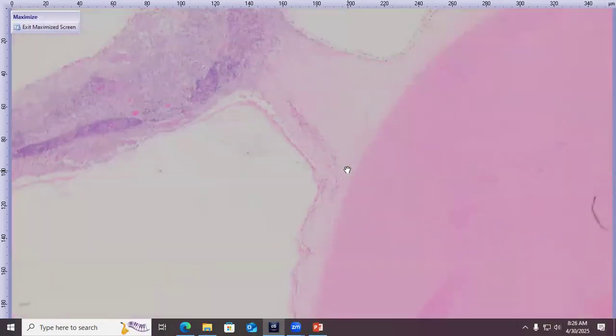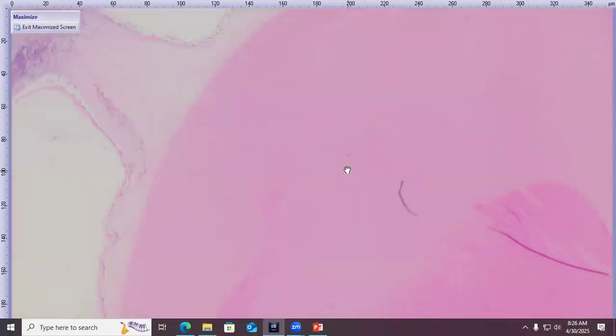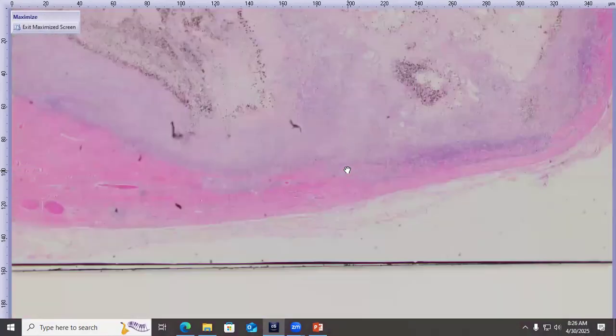And the other eye looks much the same. There's not much else to say about this case. Certainly there's a really severe cataract in both eyes as well. So this is a really weird presentation, and there's a couple of different differentials for this case. Basically showing this case to point out cases in general that don't always fall into our nice little discrete boxes. Let's find a more interesting area to drop down on while we talk about this.